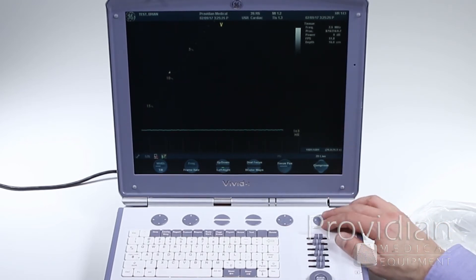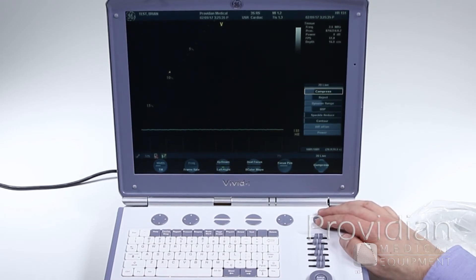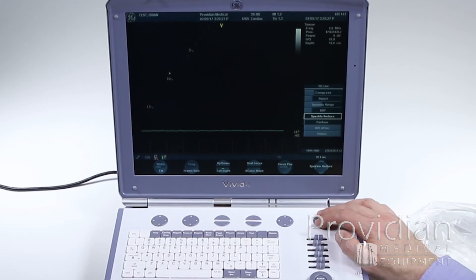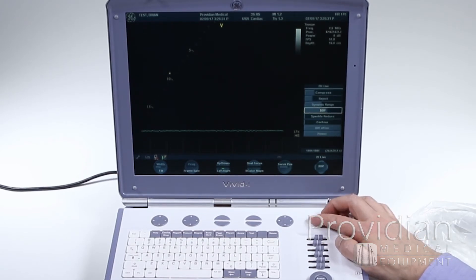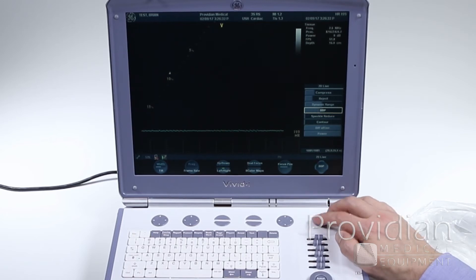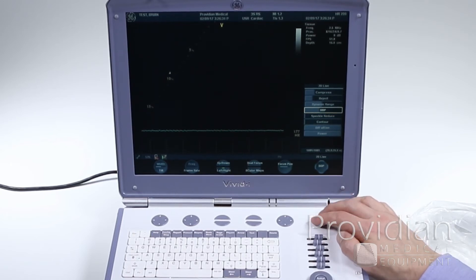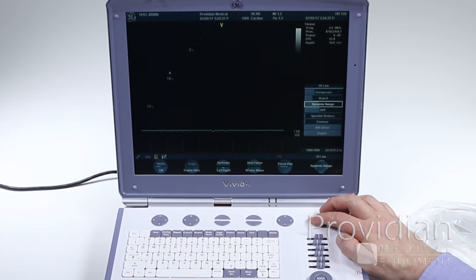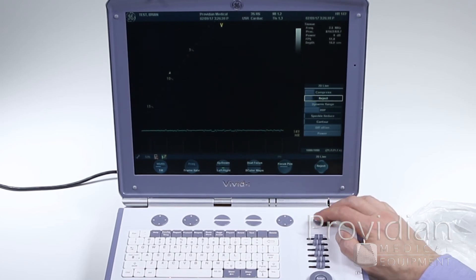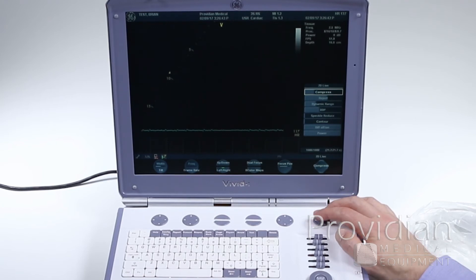We also have compression here, which is going to give you a whole other set of image optimization tools. If you are curious as to what each one does, just select it, put an image on the screen, and go all the way up and all the way down. You can change them all just to see what you like best. If you like a certain image quality better than others, you can make all these changes and then save a custom preset, which is pretty easy.